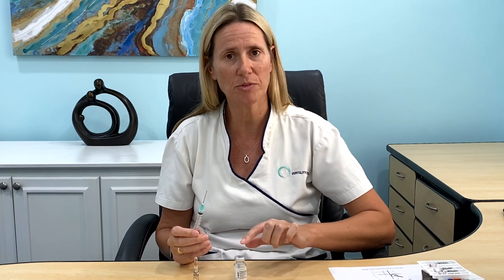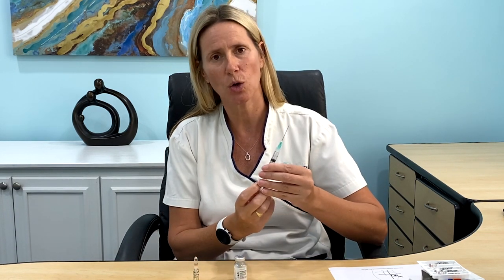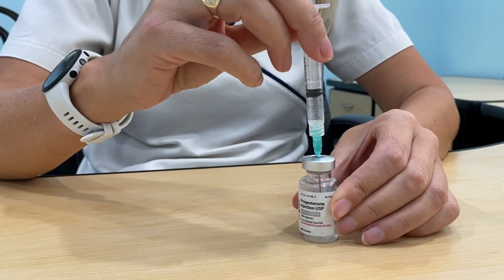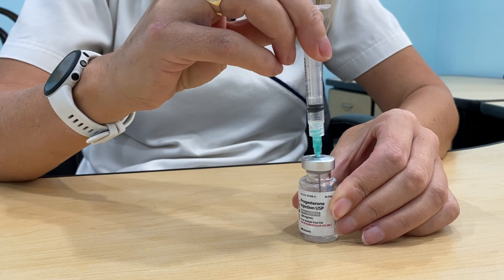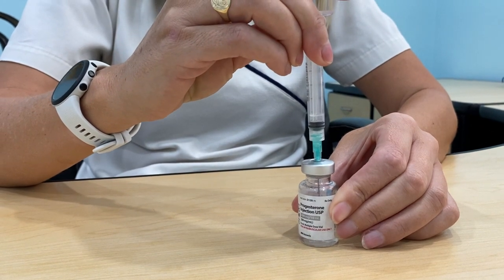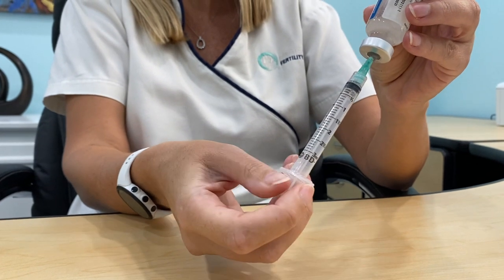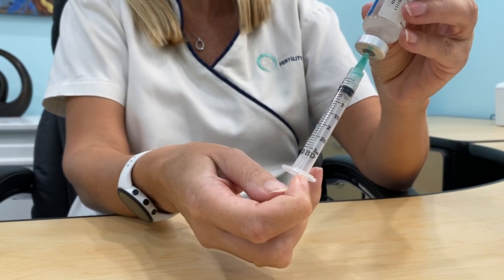If you're doing the multi-dose vial, uncap your needle and wipe the top of the rubber stopper with your alcohol pad. Draw in your 1cc of air, push it through the centre, and push your air in. Turn your needle upside down so that the point is under the fluid line and draw up 1ml of fluid. Pull out your needle.